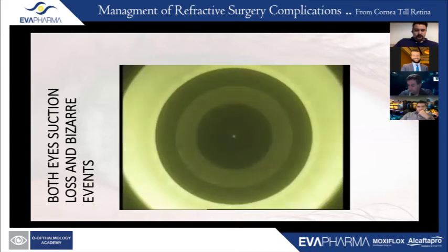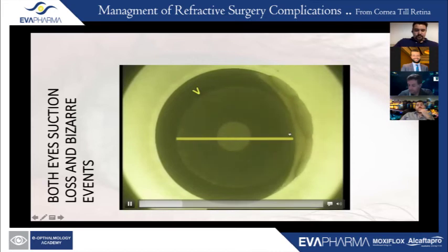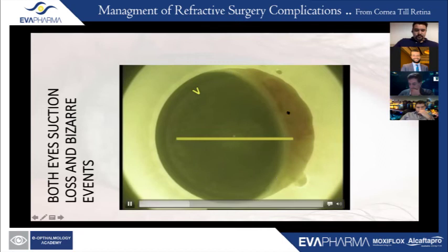Everyone was frowning. Just to understand again what happened, the lenticular cut went fine. That's the diameter of the lenticular cut. That's the lenticular side cut, and there was patient movement happening already. You can see the lenticular side cut is not exactly aligned. The conjunctiva is starting to get pulled in. You can keep seeing the diameter of the lenticular cut there. The flap cut. So part of the flap, the cap, is not dissected over the lenticule. So that's the part of the cap which is undissected.